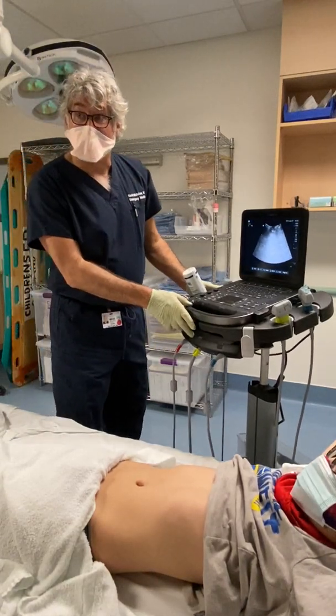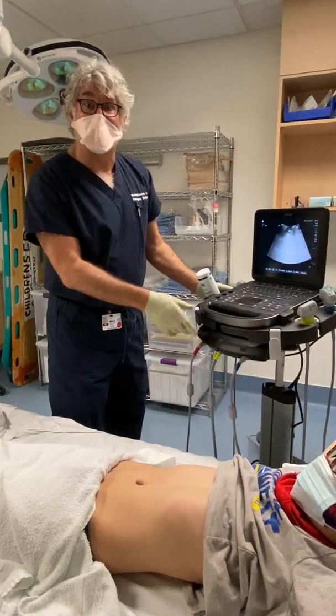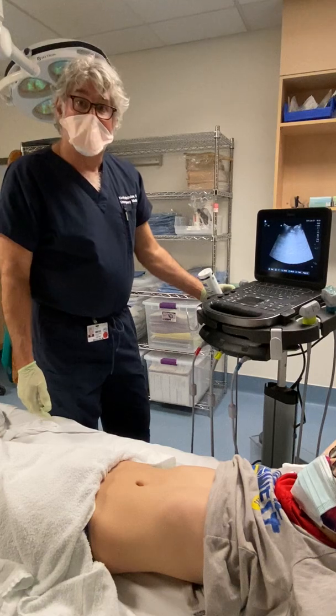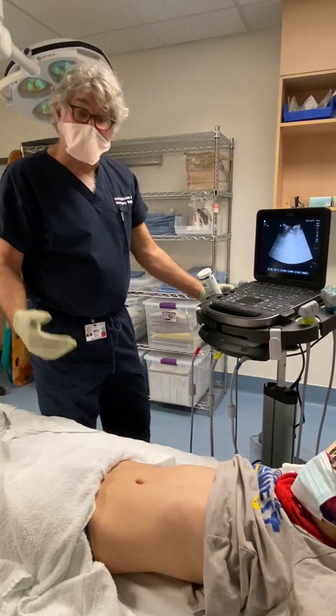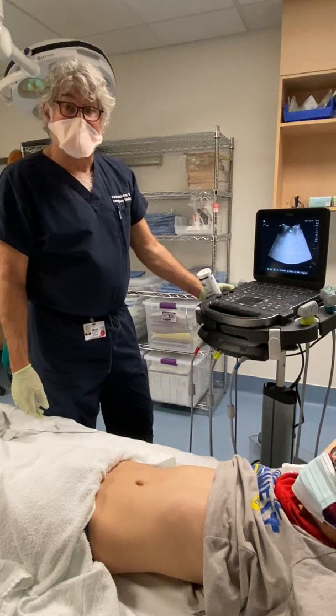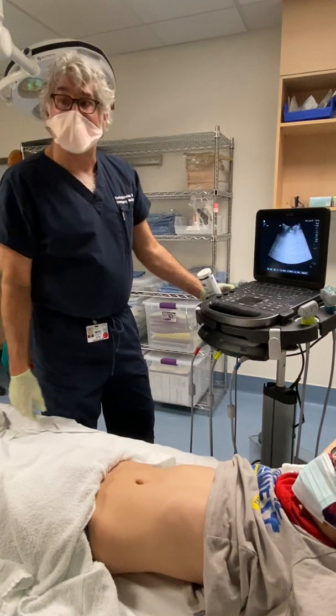Welcome to this video about bladder scanning. It's something that you're commonly going to do as a nurse in our emergency room department. The most common reason we do it is for looking at bladder volume — for example, if you're doing a post-void residual. But there may be some other indications as well.